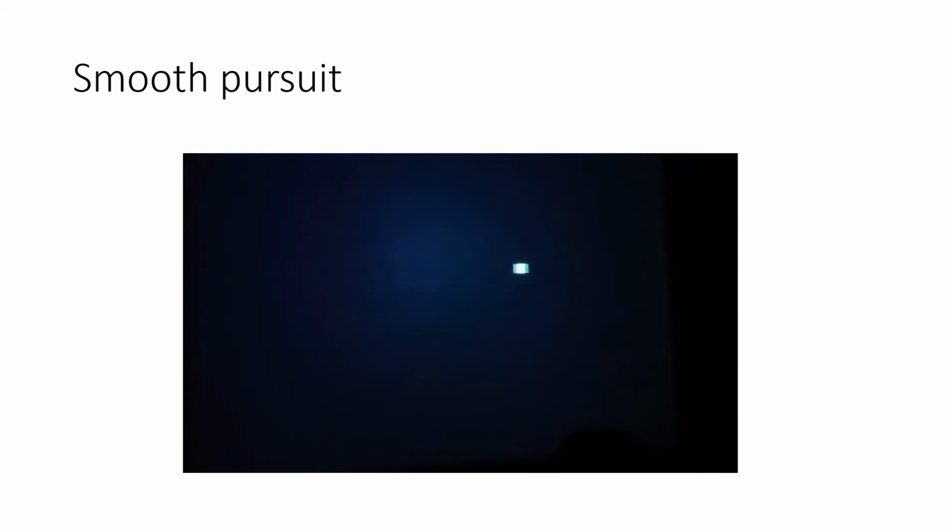This test will measure the ability of subjects to match the eye movement to the visual target movement, or how the eye is able to track and maintain the image of small moving targets upon the fovea. The fovea is a tiny pit located in the macula of the retina, which is responsible for sharp vision.